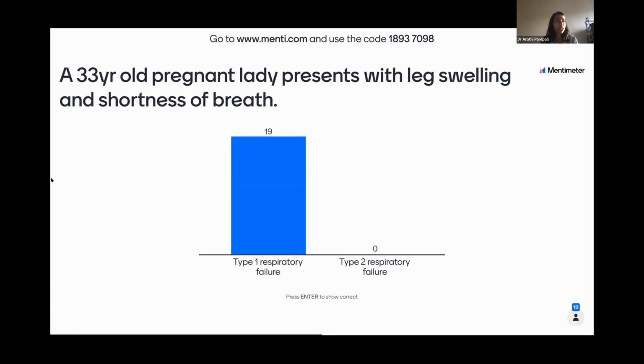So we'll just talk through the ABG then. With this ABG, you've got someone that's got a normal pH. Your PCO2 is also normal. So there's no real acid-base disturbance there, but your PO2 is low. So that means they're not adequately oxygenating, and bicarb is also fine. So this would be in keeping with type 1 respiratory failure. It's just low oxygen and no acid-base disturbance.